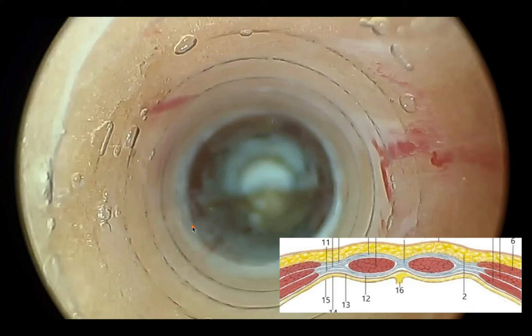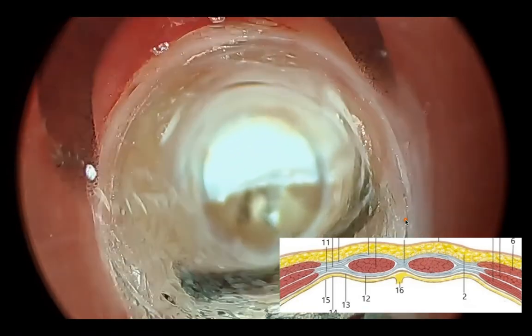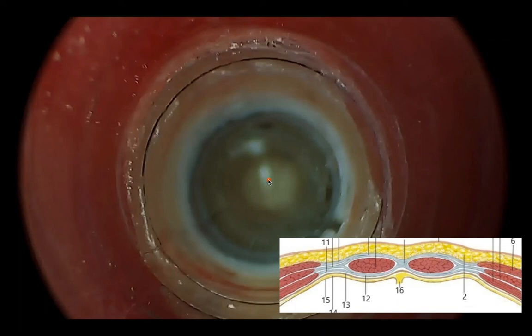We're starting to see a little bit of our anterior fascia coming in — this white circle. As we get closer, that becomes very obvious — this is our anterior rectus sheath, now that we've passed through the subcutaneous tissue. Then we see our red rectus muscle. Now we're within the rectus muscle. Right here, look at this thin white layer running just posterior to the rectus muscle — that's your posterior rectus sheath — and we're actually still pretty far from the peritoneum. Beyond that, there's a fatty layer — that's your preperitoneal fat. We can now see that clearly since the layers aren't being compressed. And then what remains is the peritoneum, which is this white tissue plane that they're going to push past. They push on the trocar and there it goes — now it's appropriately placed and they pull everything out to start insufflating.